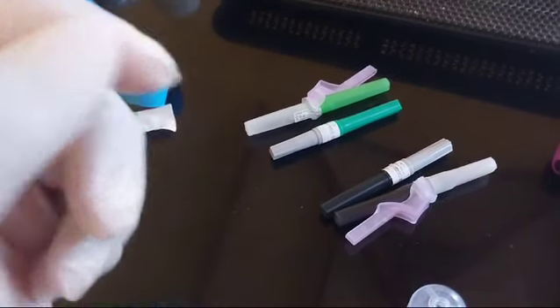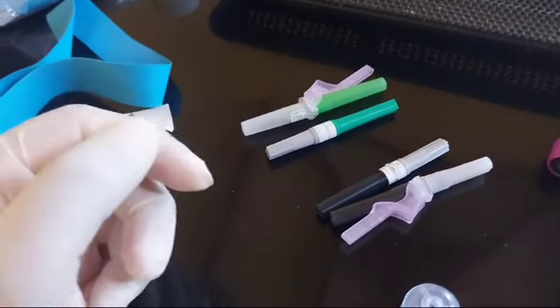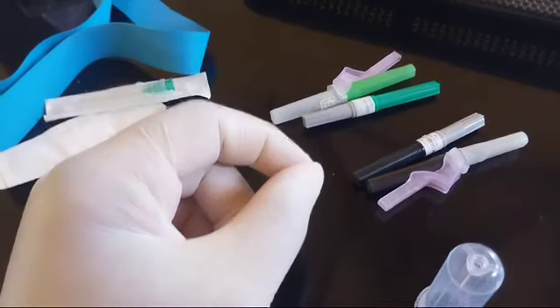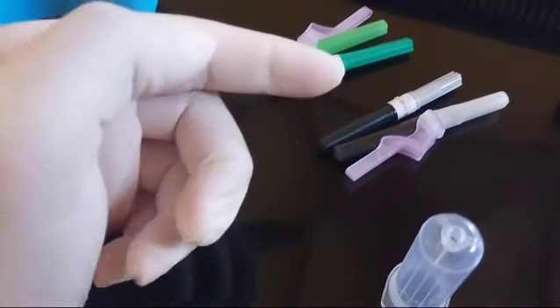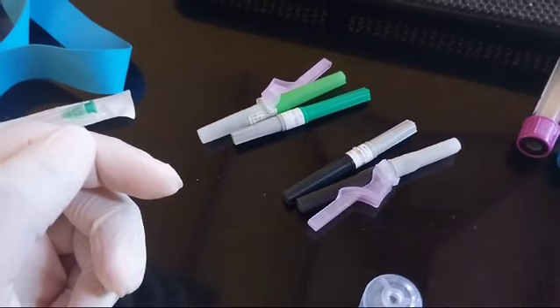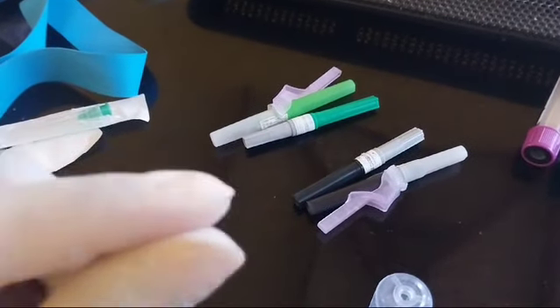Which needle you choose depends on the size of the vein you're going to draw blood from. If the vein is on the bigger side — a really good vein — you'd go for a 21 gauge needle. If it's on the smaller side, you'd go for a 22 gauge. There's also a third gauge — a blue one, 23 gauge — if the vein is really small. So basically, needle selection is based on the size of the vein.